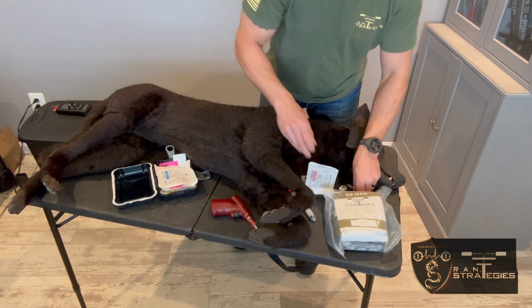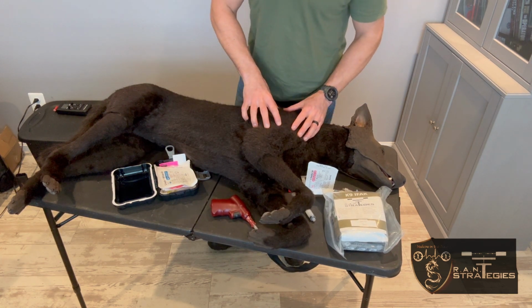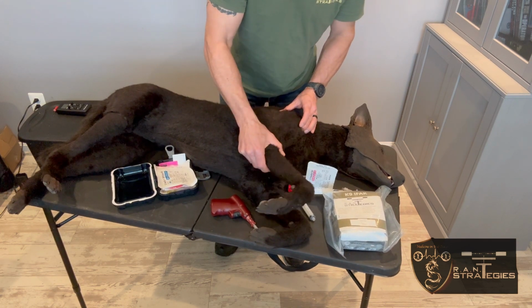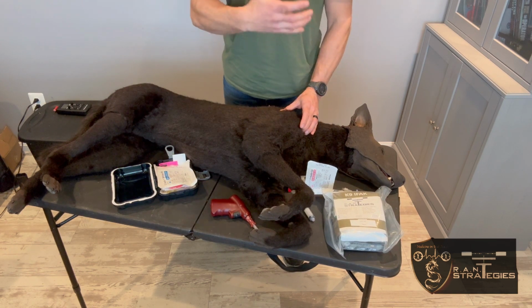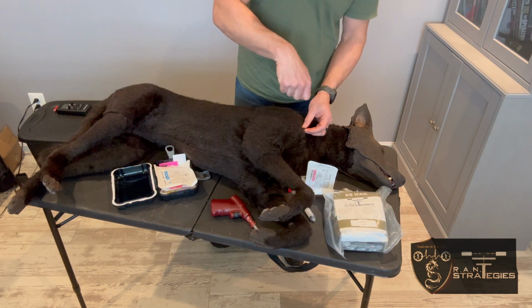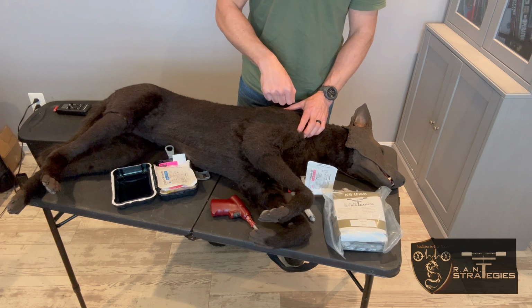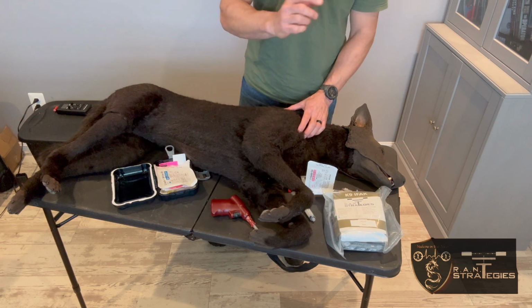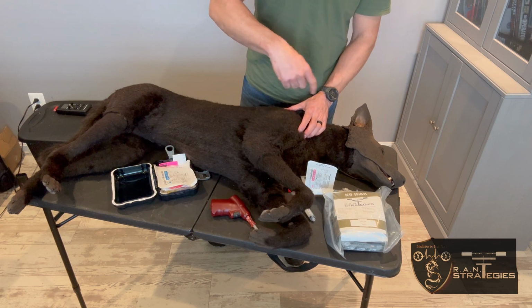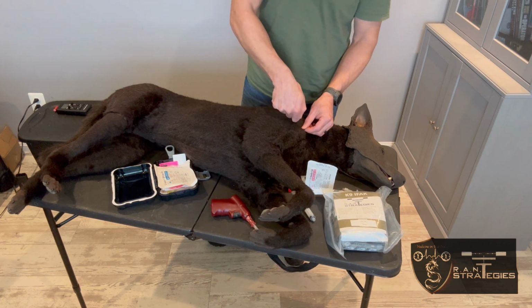We have our syringe. So what we're going to do is, the first site we're going to utilize is the proximal humerus. So we just feel around, we feel where the bone is, we find our site. In an actual canine patient on a real dog, you would need to take a scalpel and just do a small laceration and cut the skin, because you insert the needle on the drill into a dog, because their skin is so loose. As soon as you go to advance the drill or advance the needle, the skin will just bind up around the needle and stop the drill.